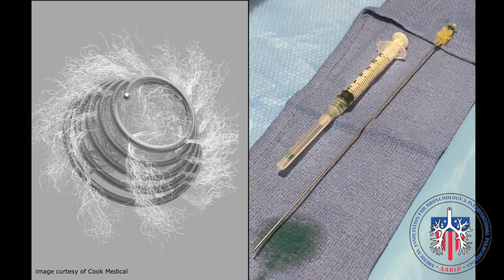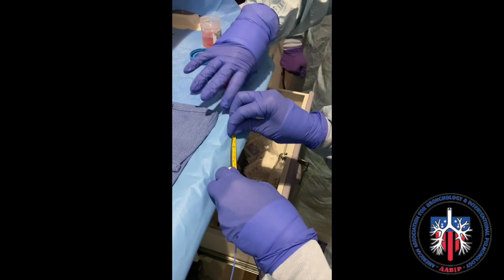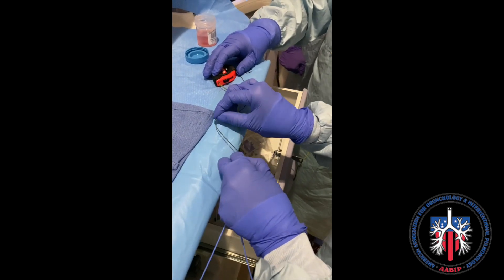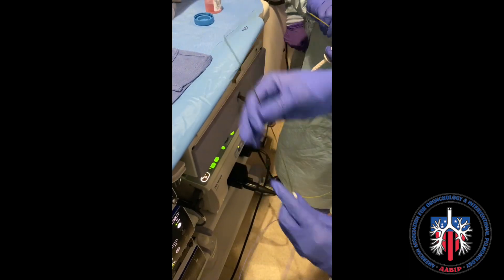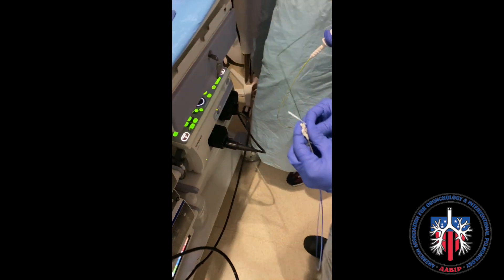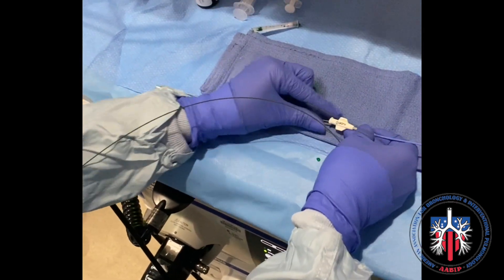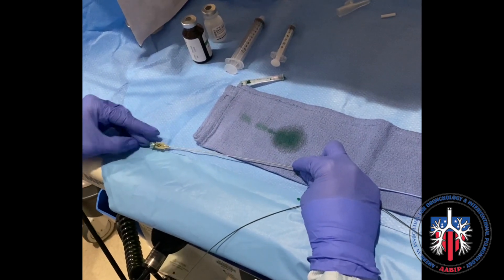In this case, we use the 7x3 coil fiducial — the only fiducial that fits within the deployer from the Mitronix Superd loading kit for fiducials. Pre-loading the fiducial with measurement of the length of the loading catheter and guide wire is helpful prior to pushing the fiducial into the loading catheter, as shown here.